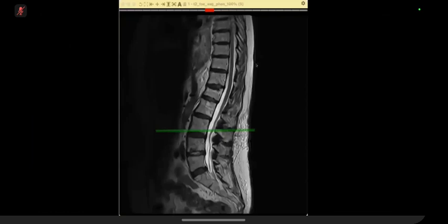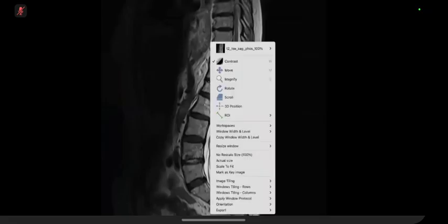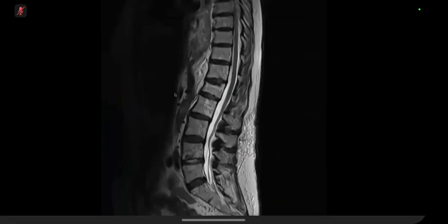Now, so this is, are you with us? Yes, doctor. This patient is 87-year-old, right-sided, butt pain and hip pain, rule out sciatica. Right. Can I request control, doctor? Yeah. Have you asked?